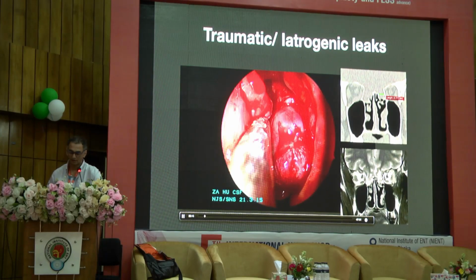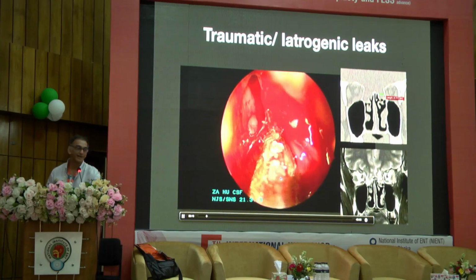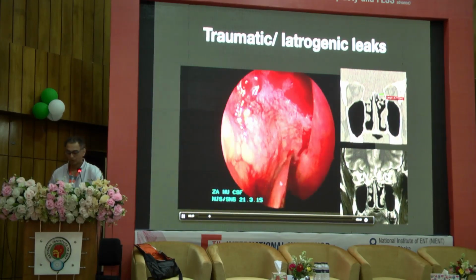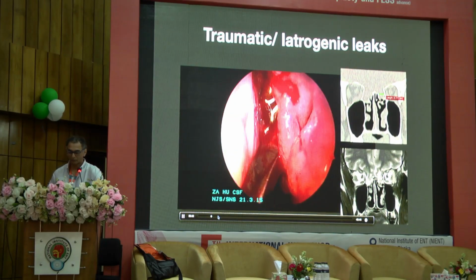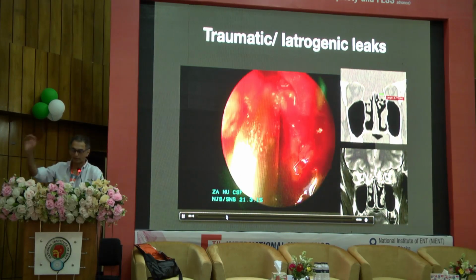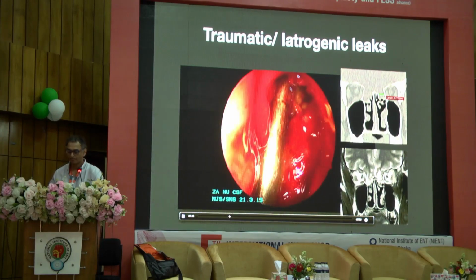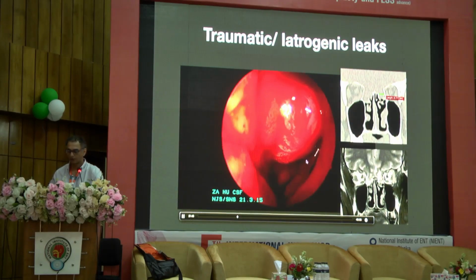So first thing for me to do is to understand where I am. I don't know where I am in this area. You see part of the uncinate is still intact. Fortunately, middle turbinate was intact, ground lamella is intact, and yet this has gone in. So we have to find first the frontal sinus and the maxillary sinus so that I know where my landmarks are. I don't want iatrogenic sinusitis, so I want those sinuses to be open. So frontal sinus opened above, frontal supraorbital. Then we open the maxilla below it. So now I know where I am. I know the rest of it is now all ethmoid.